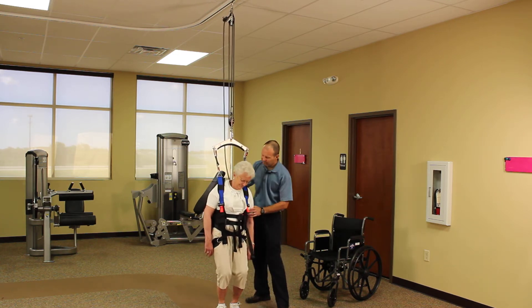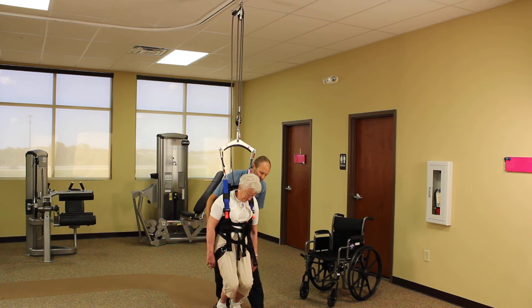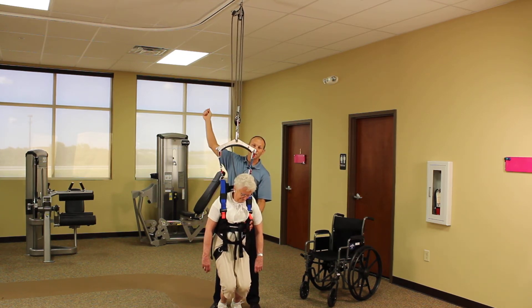So let's have our patient become incapacitated. First, if you have a person with you, they can come in and support the patient, lift up slightly on the patient so that you can take some of the tension off the pulley system so that it's easier to disengage.